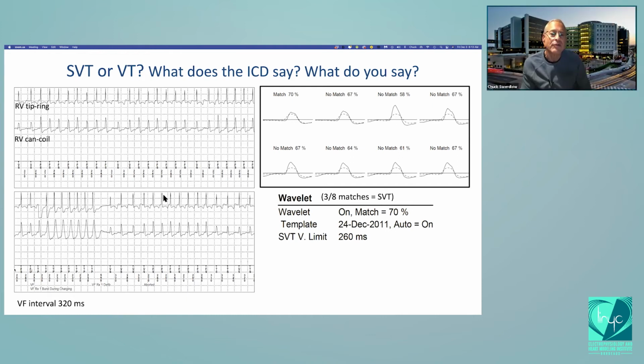So the defibrillator, so again, great work. What we have here is an irregular rhythm with beat to beat variability in amplitude, but none in morphology. And we notice that after a pause, the amplitude is lower.